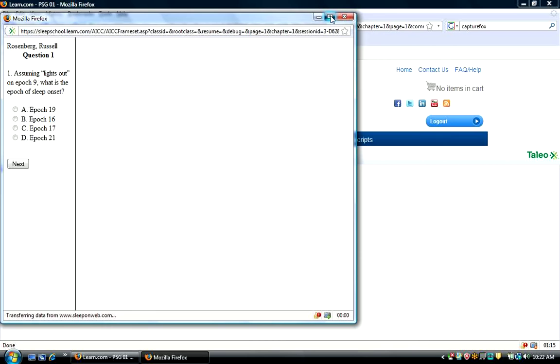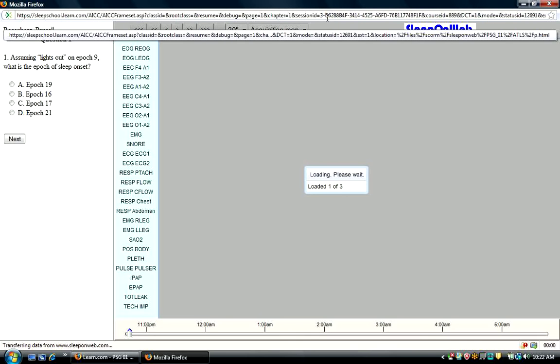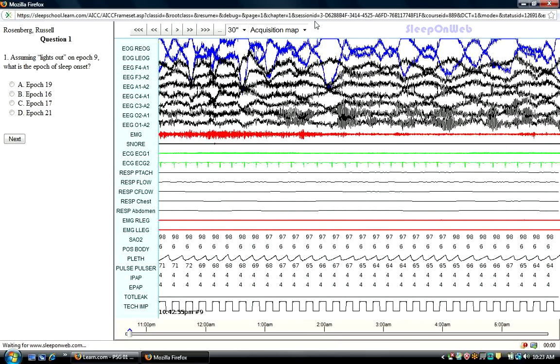At the same time, I'm going to maximize my screen so that I can see the entire PSG, and what you see here now is a complete montage.